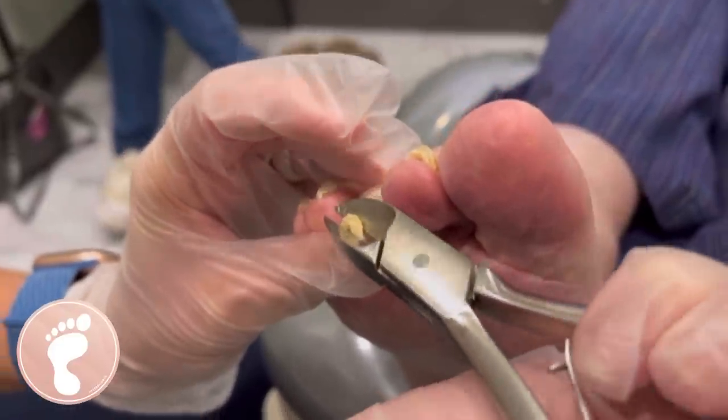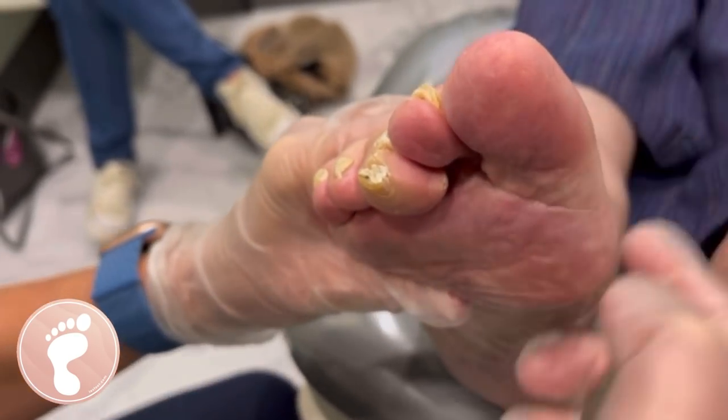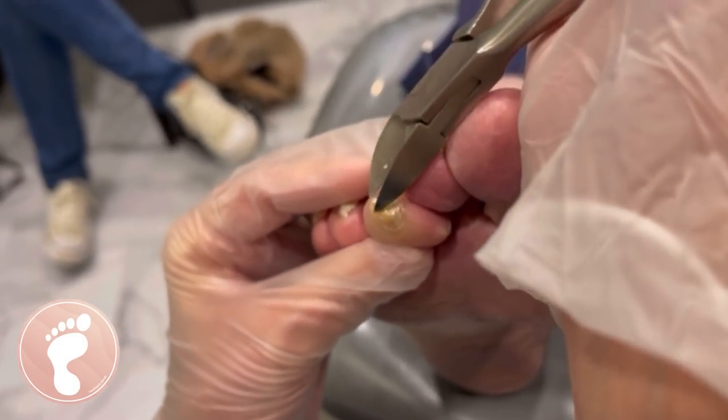This is more comfortable to get the big bulk of it. So if you take a blade straight to it, it's going to be more uncomfortable because it's almost going to just tug and pull.